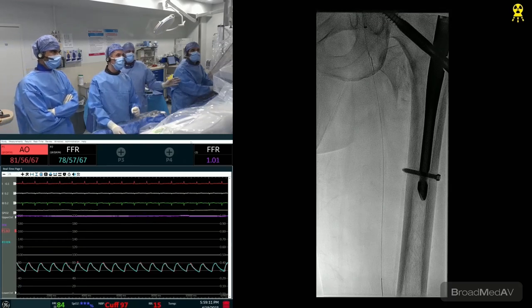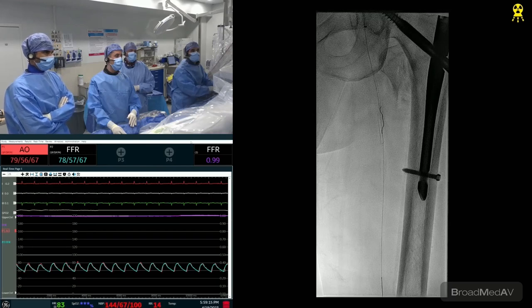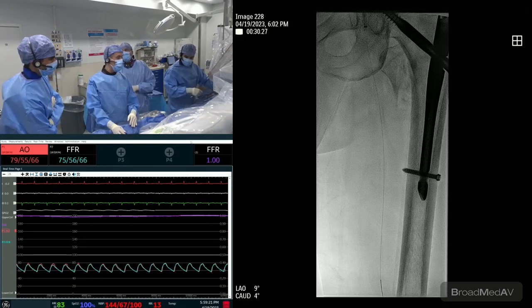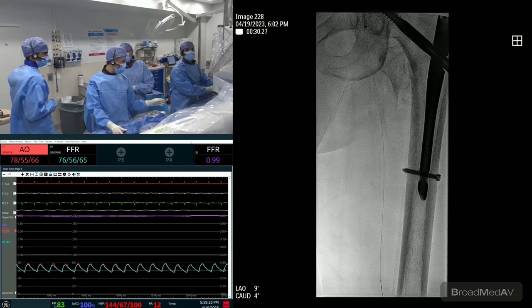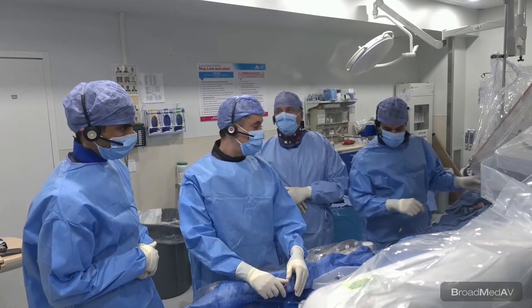But anyway, for now, just because time's up, we're going to go ahead and check the pressure with the catheter, and then we'll decide what we're going to do. You're on the plane. So it looks like it may end up being a dissection with the wire that we're going to have to deal with. So check it with a catheter, and if we have to stent, we stent.